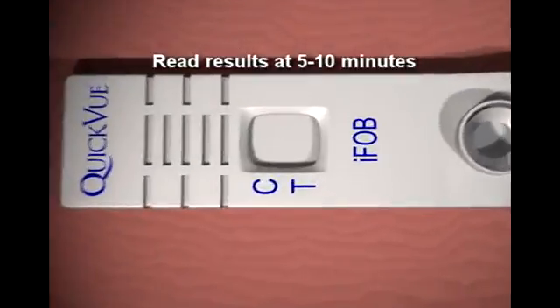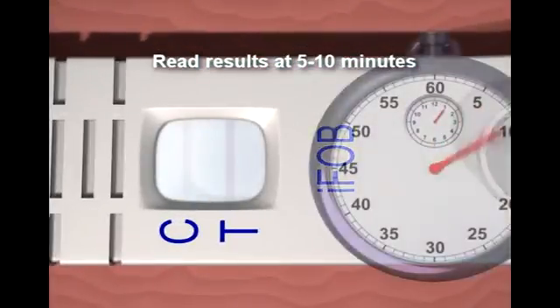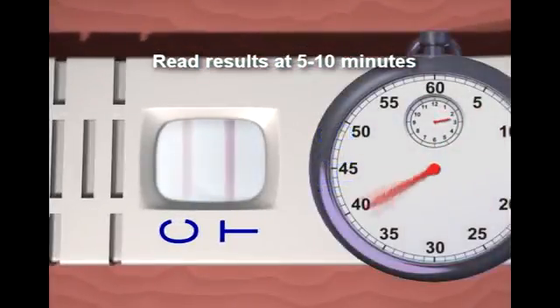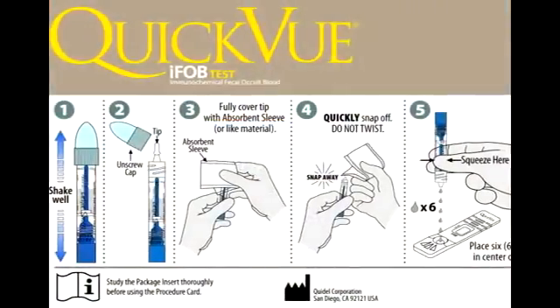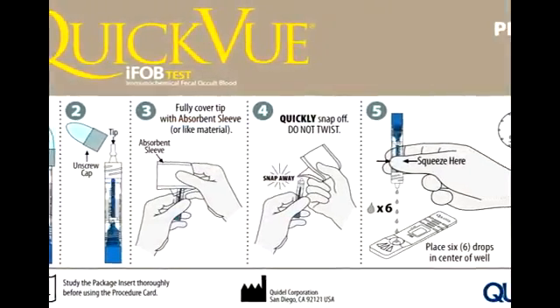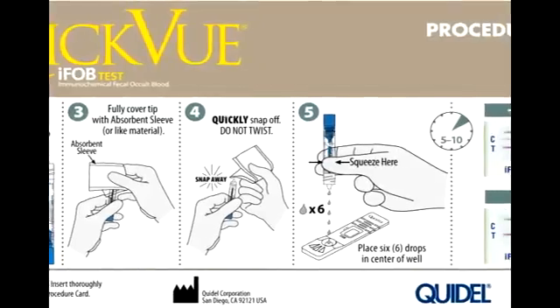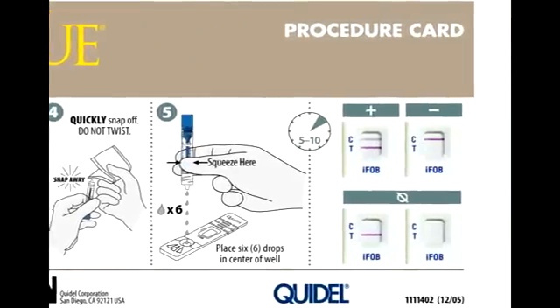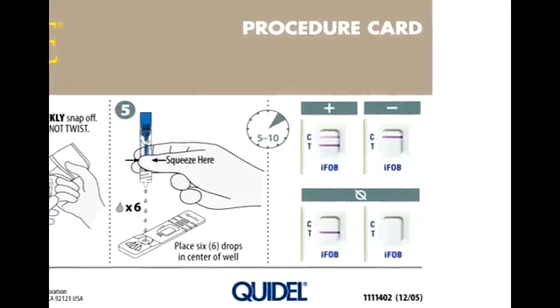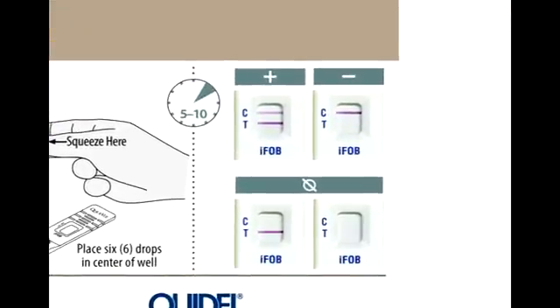Read results at 5 to 10 minutes. Some positive results may be seen earlier. Test results should not be read after 10 minutes. Refer to the procedure card for visual color interpretation of the test and control lines. Both the test line and the control line appear as a burgundy color.